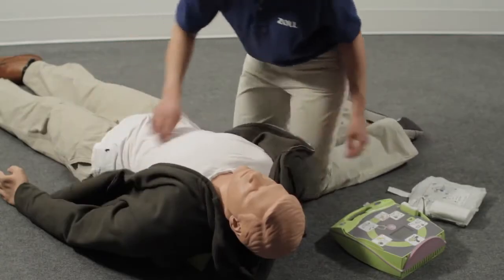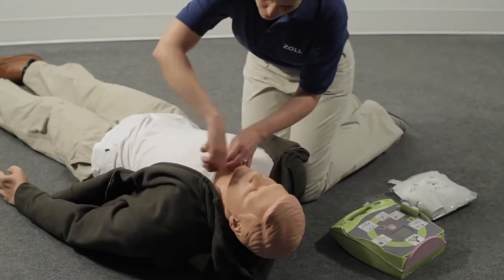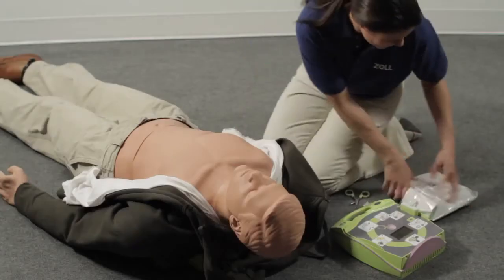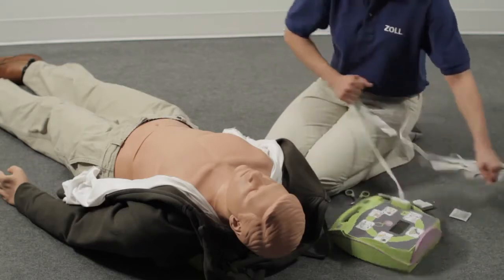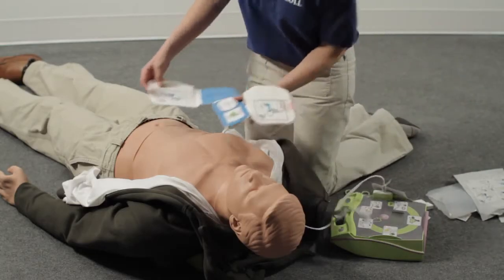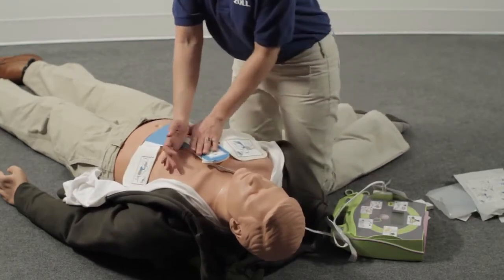Attach the defib pads to the patient's bare chest. Dry the chest if necessary, and quickly shave it if there is heavy chest hair.